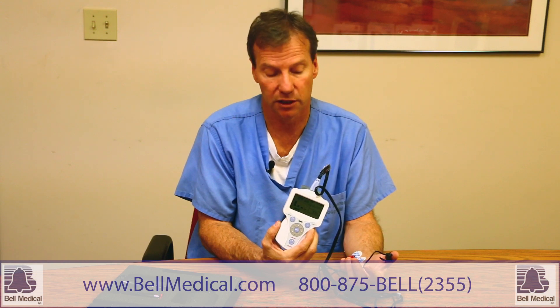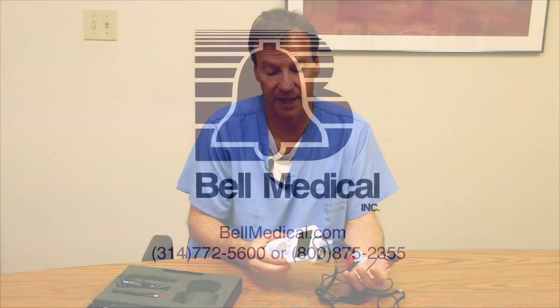The Stimpod basically offers you the ability to do nerve location, but the most exciting thing is it gives you a way to monitor your train of four in a very easy, quick way. Thank you.